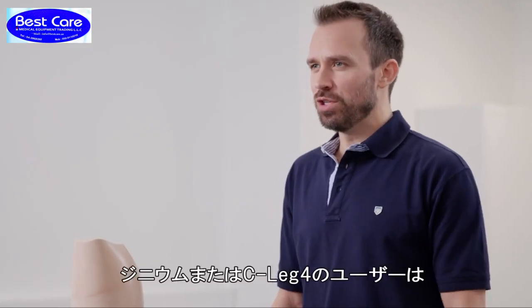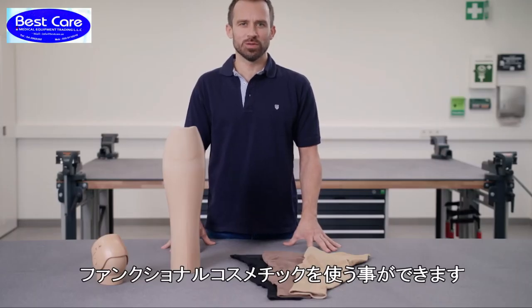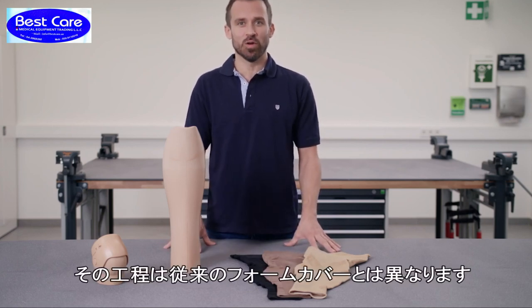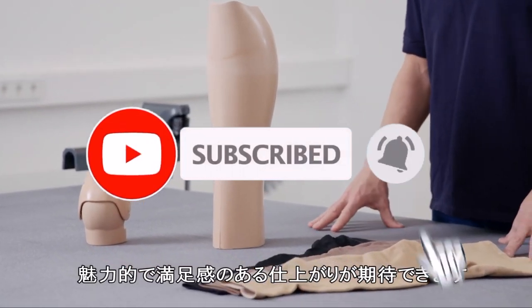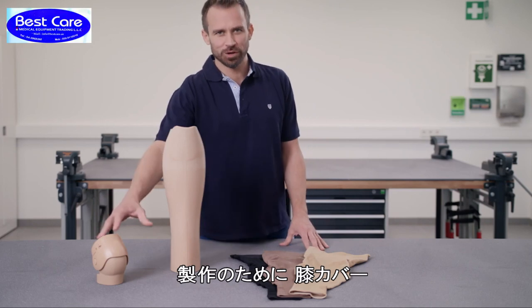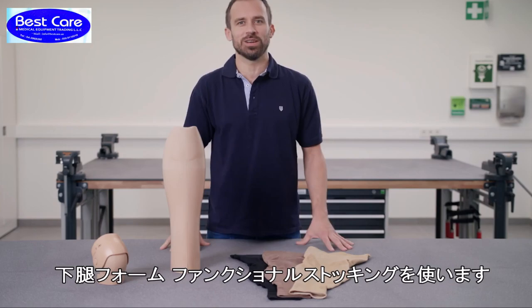If you are fitting the Genium or C-Leg 4, you can use a few additional components to fabricate a functional cosmesis which is quite different from a conventional foam solution. It looks attractive and will impress your customers. To do this you will need this functional knee part, the shank, and finally this functional stocking.